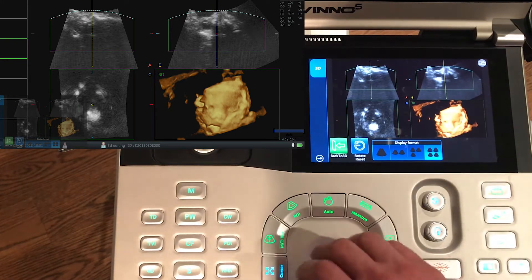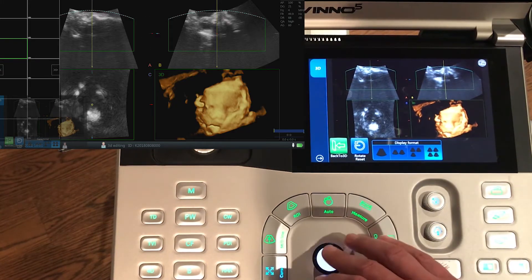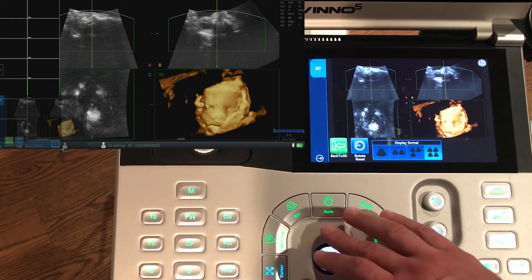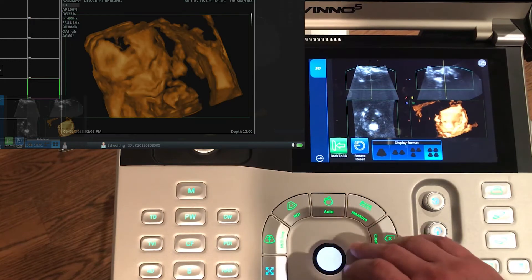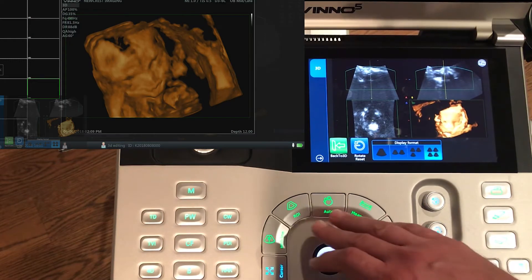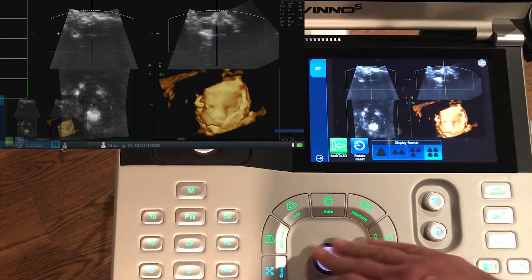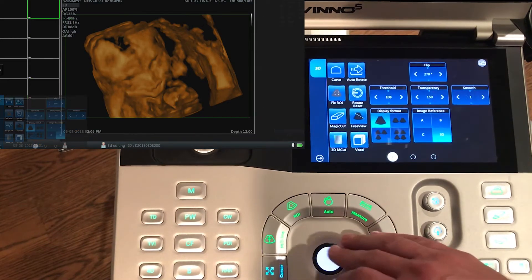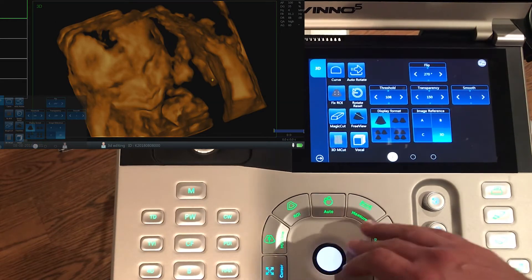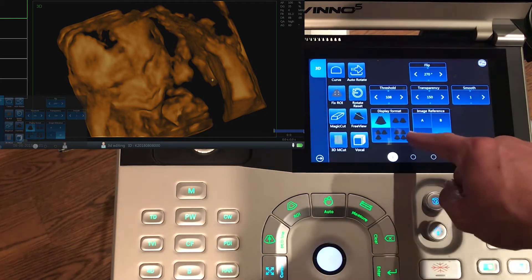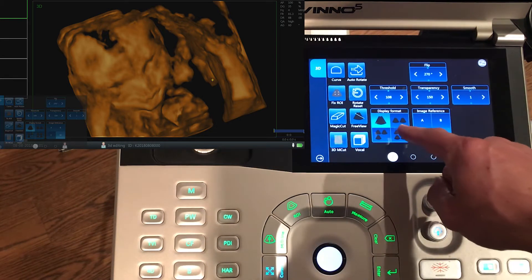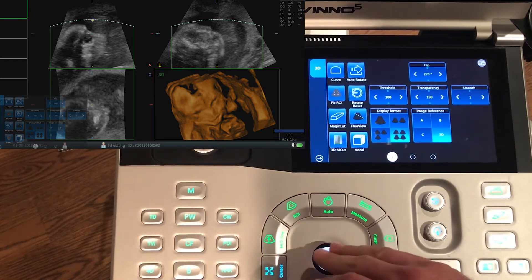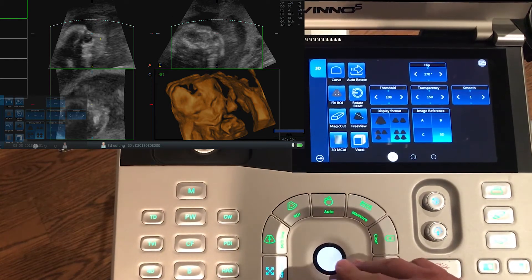Let's take a look at another image from this series. Here it is — this is another image we've got to look at. Same thing again, we go straight to the four-screen view so we can have a look at what the 2D image is. In this case it's a much more promising 2D image.